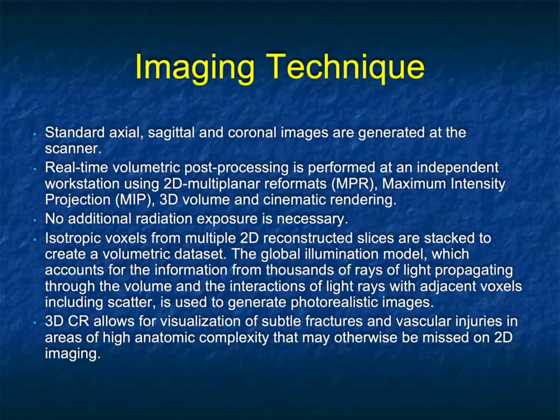From the technologist's perspective, you want to position the patient comfortably. If they can't lay flat, let them lay on the right side or left side. What you really don't want is motion during the study. Motion will cause problems. As long as the patient is still, the study will be excellent.